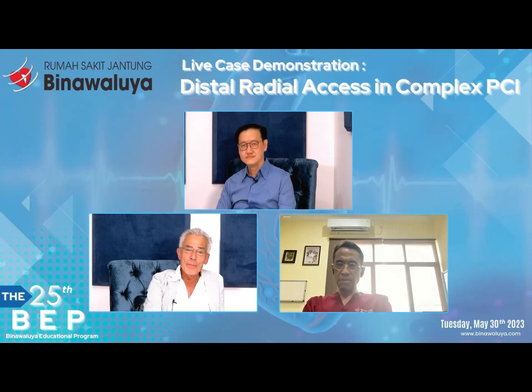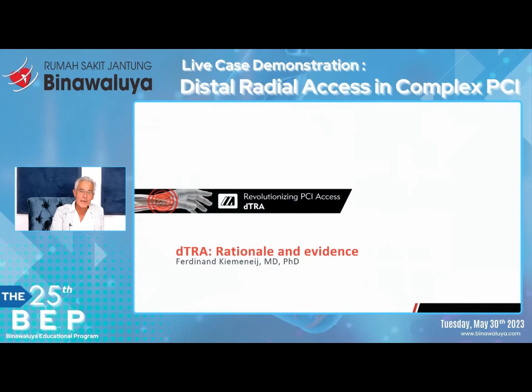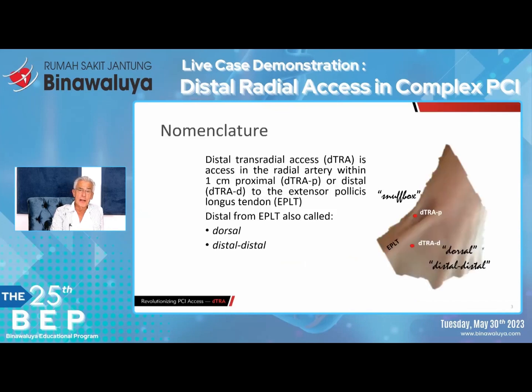I'm happy to inform you about the background of distal radial access, the rationale and the evidence so far. It's a young technique. I think distal radial access can be considered a refinement of conventional radial procedures, and I'm happy to explain how and why. More the why than the how, actually. So let's start with the rationale.